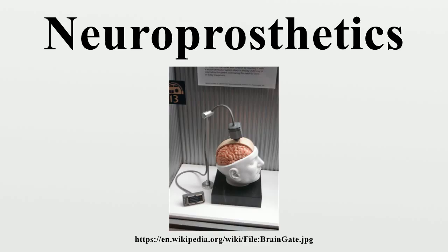The neuroprosthetic currently undergoing the most widespread use is the cochlear implant, with approximately 100,000 in use worldwide as of 2006. History. The first known cochlear implant was created in 1957. Other milestones include the first motor prosthesis for foot drop in hemiplegia in 1961, the first auditory brainstem implant in 1977, and a peripheral nerve bridge implanted into the spinal cord of an adult rat in 1981.